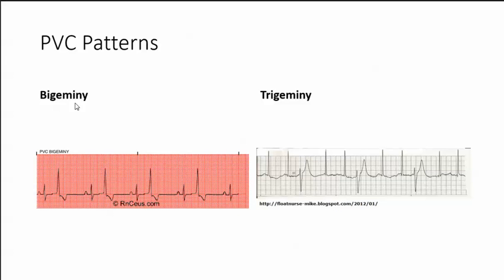Bigeminy is when every other beat is a PVC. See how we have a normal sinus, PVC, normal sinus, PVC.